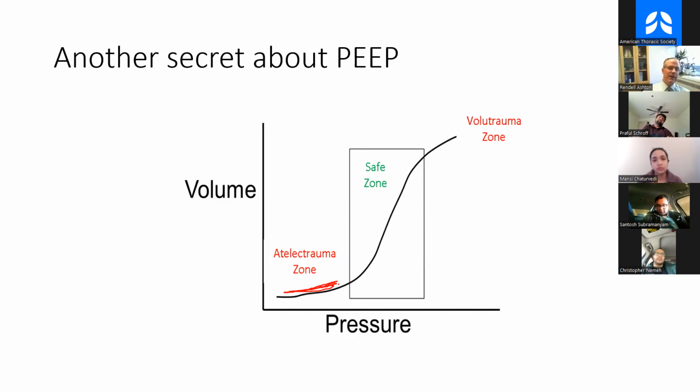So we don't want that. We don't want those alveoli collapsing and popping open, collapsing and popping open. They're pretty fragile as we know. And so all those shear forces damage the tissue and lead to worse and worse gas exchange. And ARDS is many, many times an iatrogenic disease, right? That we cause by our ventilator.